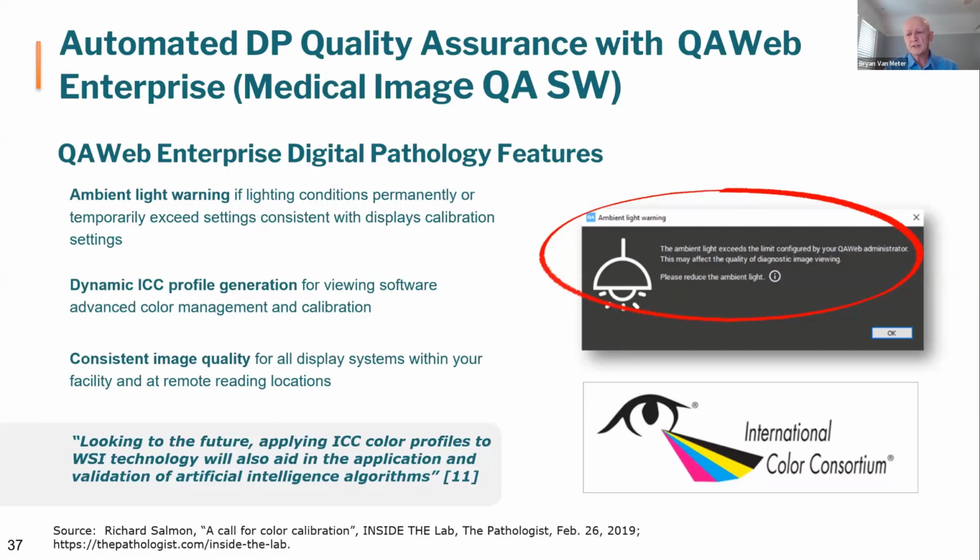And as I mentioned with Leeds before in their webinar, Dr. David Brattle is his name, he has a saying, and it's webinar number 7, one of their last ones. He says, you can spend hundreds of thousands or tens of thousands of dollars to get the best display on the planet, but if you're not sensitive to the environment in which it's used, you've really wasted your money. He says it a lot more colorfully than that.